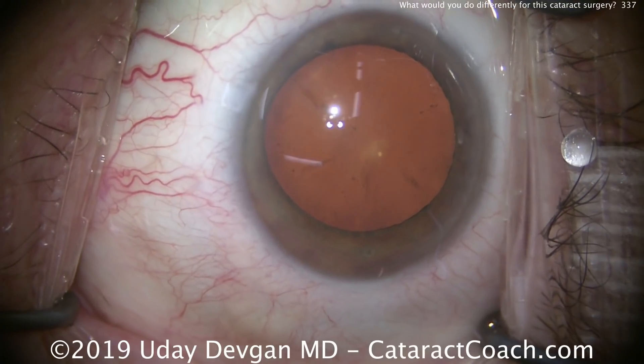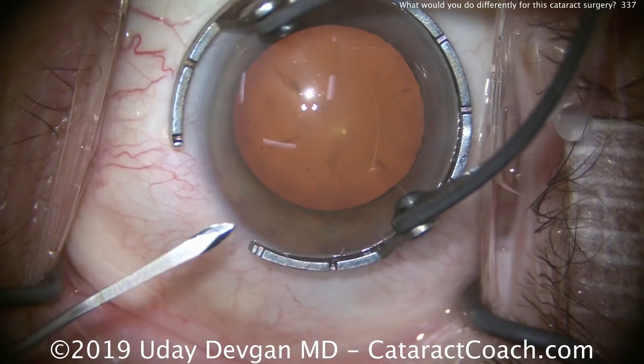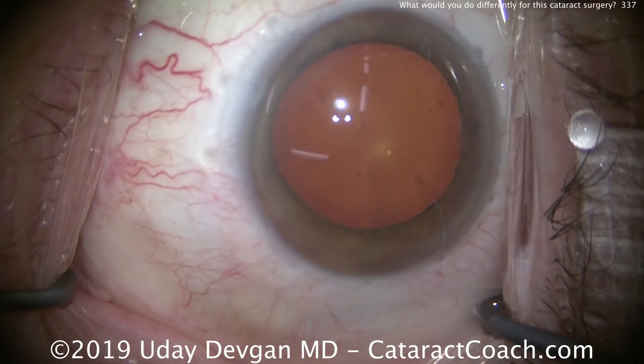So what should we do differently in this case? Now, luckily, the patient has good endothelial cell function and still has a corneal pachymetry that's reasonable at 560 microns.